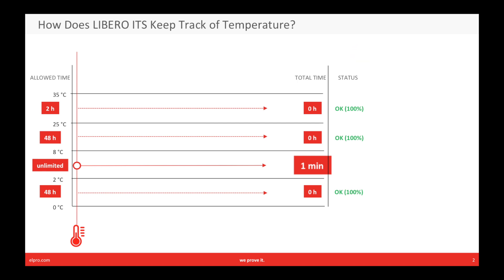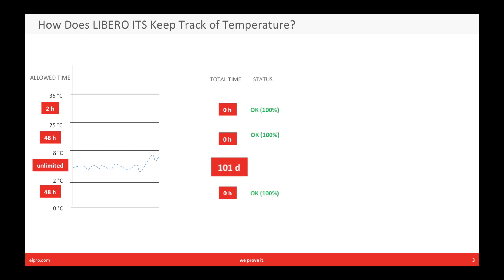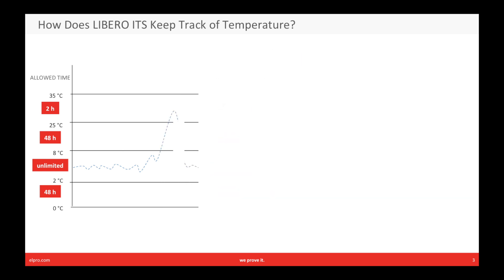Libero ITS now keeps on measuring. We stay between two and eight degrees for a long time. The total time now shows 101 days in the good zone. The alarm status still shows all okay, 100%, so the overall stability budget is still 100%. Now we run into a temperature deviation that rises above the good zone — we see three hours in zone one and one hour in zone two.